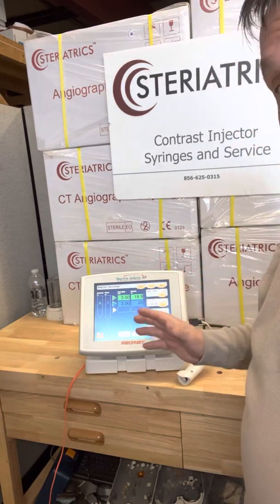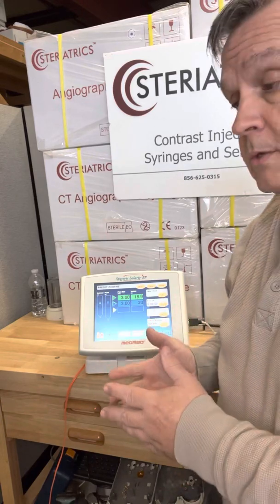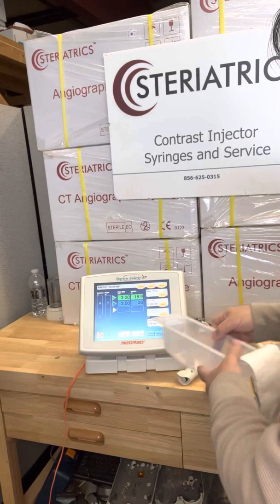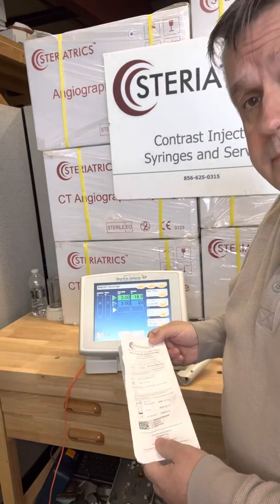325 is where they always have these set. I hope that helps answer some of your questions on how to operate this injector. Just please remember, if you're looking to buy syringes, consider Steriatrix — it's our M302 brand. Thank you very much.